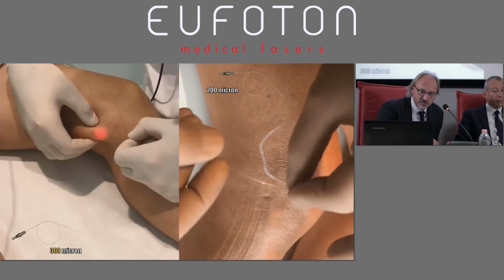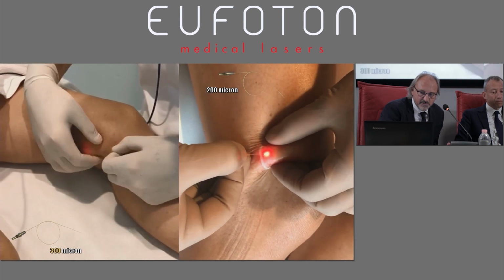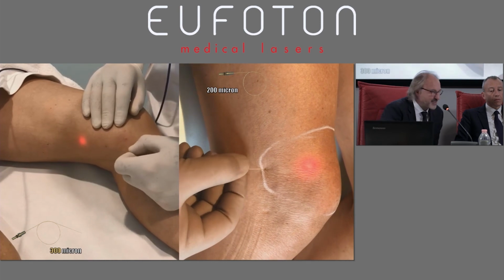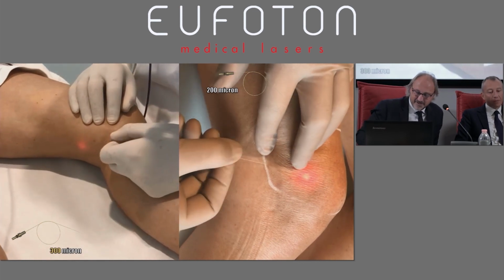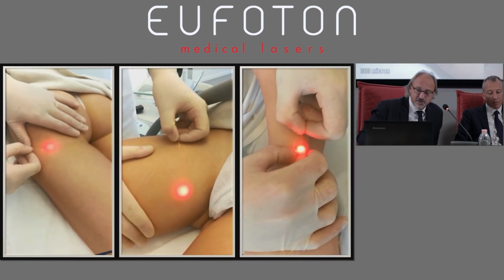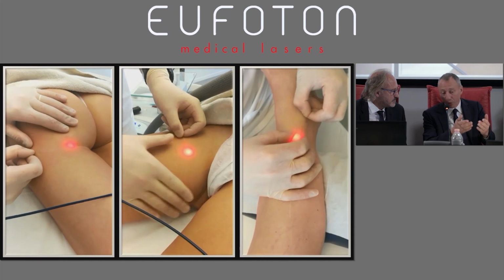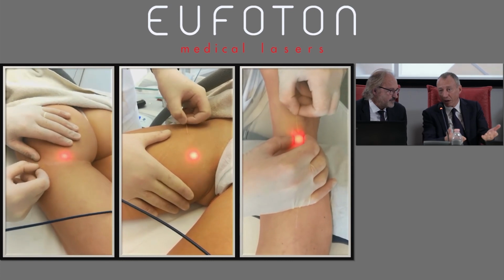So we have a fiber, 200 micron fiber. Is it 200 micron? Yes. I prefer the 300 micron fiber. It's up to Domenico this time. Domenico works with me, so he likes the 200 micron fiber. That's Domenico's choice. It's more focused, it's more energetic, it's more difficult to handle, but it's more energy releasing. For longer parts or trips, so the 300 is stronger. So that's what I mean. Absolutely, you're right. Yes, I agree with you.